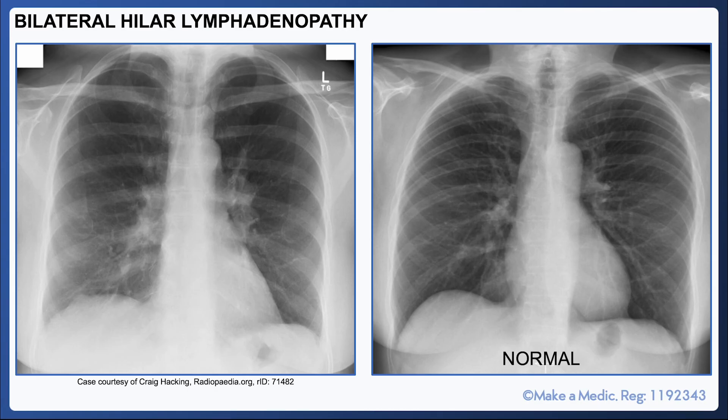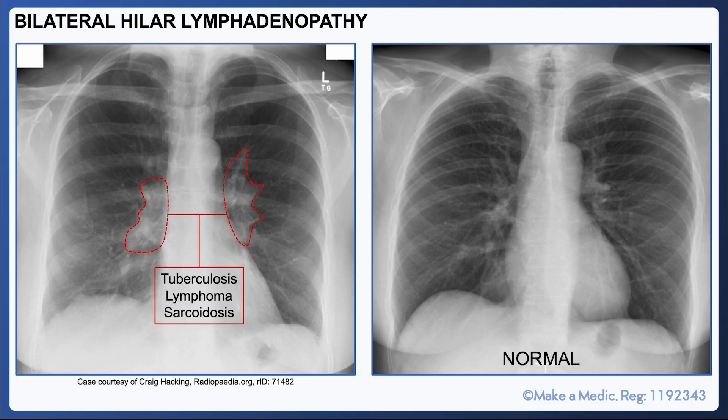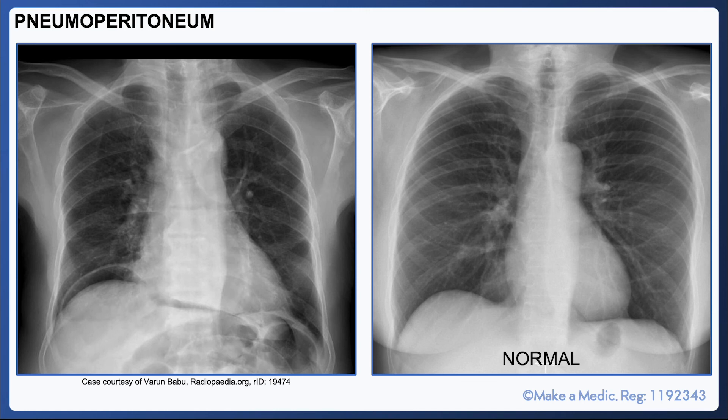Bilateral hilar lymphadenopathy refers to enlargement of the hilar lymph nodes. When you inspect the hilum, it looks much bulkier and more obvious than it would on normal chest X-rays. Causes include tuberculosis, lymphoma, and sarcoidosis.